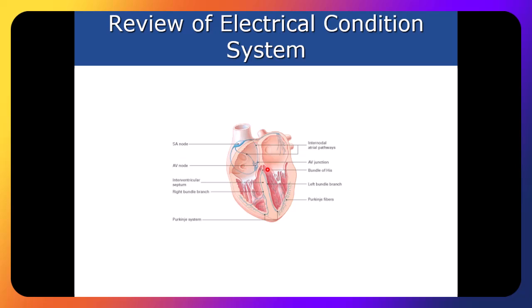Okay. Anybody else? What else might you see? Could we expect the electrical signal to go the opposite direction? Well, if it starts here, and remember that whole excitability property of your heart says that when we get an impulse, it gets shared. Then basically it's going to have to go back up this way. How's that going to be reflected on your normal lead 2? What do we call that? We have a negative deflection or an inverted P wave. Yep, a down loop.